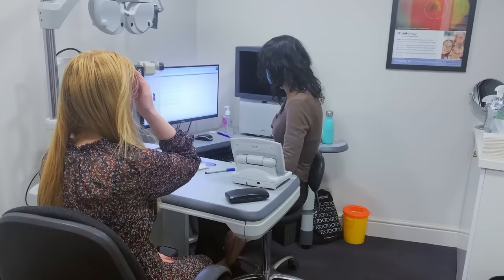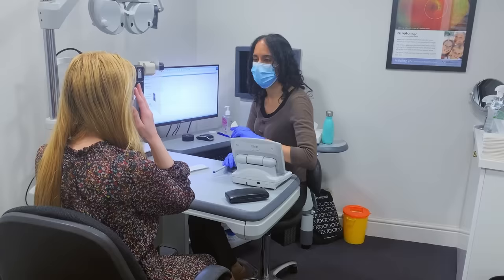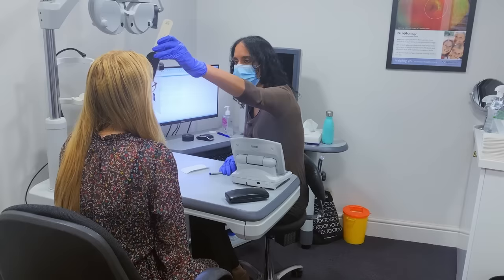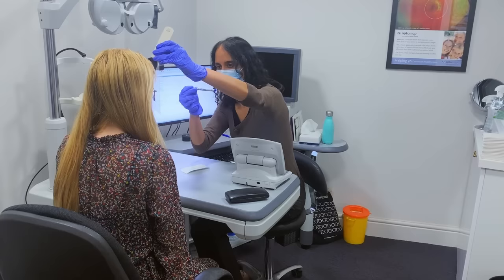Very good. Excellent. So, if you have a look with both eyes together now, you can look at the E just at the beginning of the top line. So, I'm just going to cover and uncover your eyes. I'll just check how well your eye muscles are working together. Very good. Lovely. And then if you can look at the H for me down here next to my finger, I'm going to do the same thing again. Okay, brilliant. Thank you.